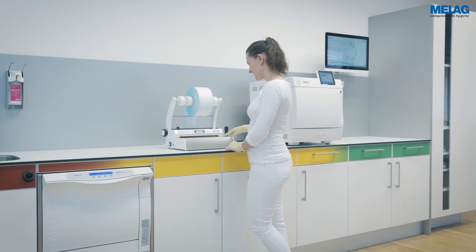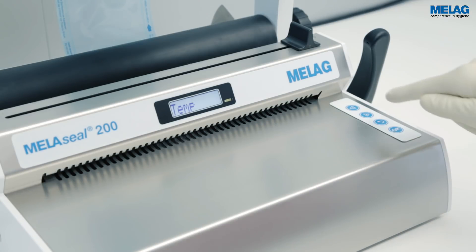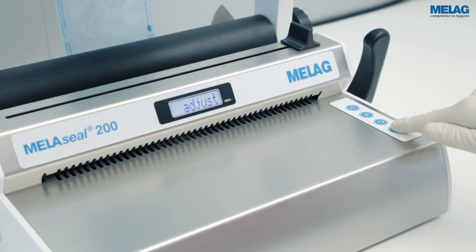To set the time, navigate in the Settings menu to Time and press the OK key. Confirm the display notification, then adjust again with OK. The time can now be adjusted in a similar way to the date setting.